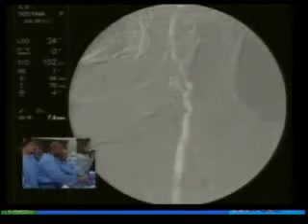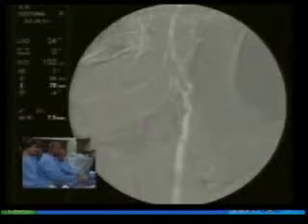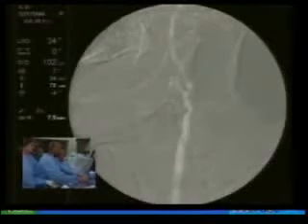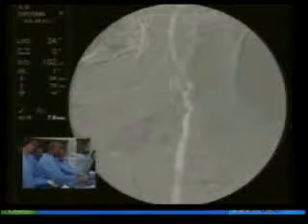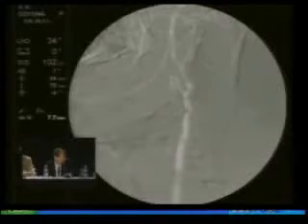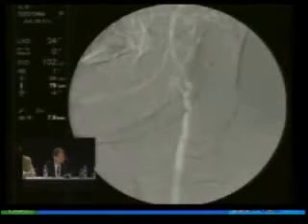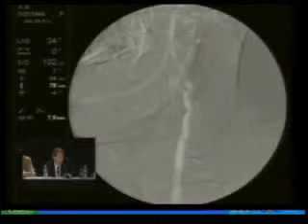And if somebody does get in trouble, as Ty mentioned, if you occlude the carotid and they show symptoms and you just deflate the balloon, wait a few minutes, let the pressure come up a little bit, and reinflate, they'll usually sail right through. Yeah, there's ischemic preconditioning, I think, that happens. And I'm really impressed that in patients who are recently symptomatic, or if they have a really echolucent plaque, this may be the thing that gets us through and gets our results up to the same as endarterectomy.